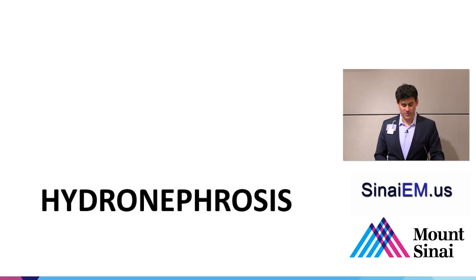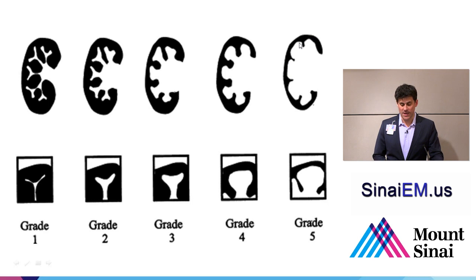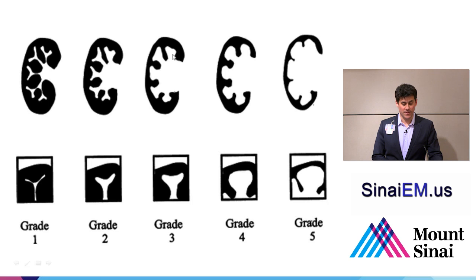The primary thing we're looking for is hydronephrosis, which is typically described subjectively from grade one — almost no hydronephrosis — to grade five, where the renal architecture is entirely obscured by the dilated collecting system. Basically mild, moderate, and severe hydro. The bear-claw shape of the inner collecting system dilates and spreads to obliterate the architecture, in contrast to a cyst.